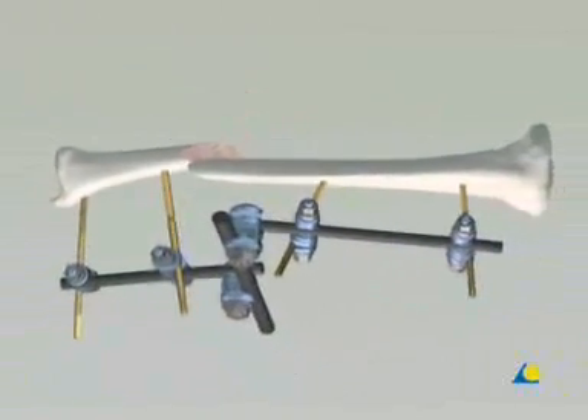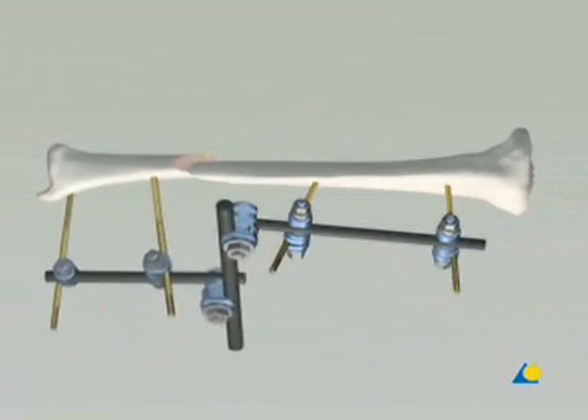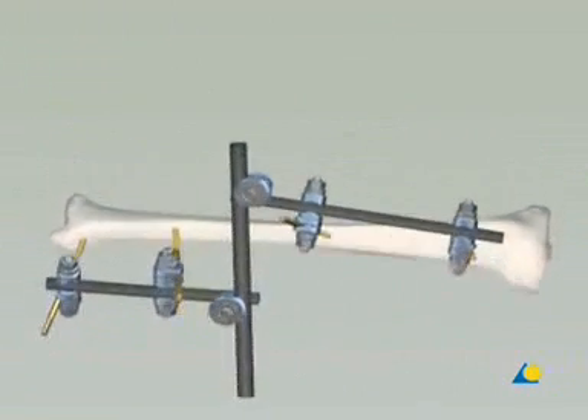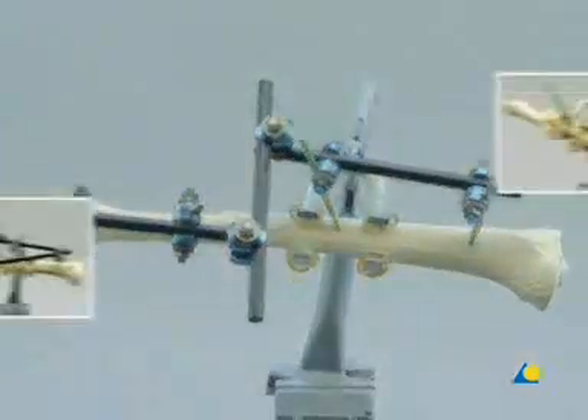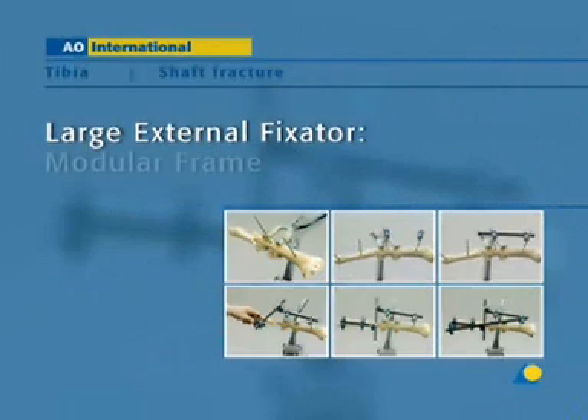In this presentation, a type 4-2-A1 fracture of the tibial shaft will be reduced and stabilized using the large external fixator with a rod-to-rod modular frame.